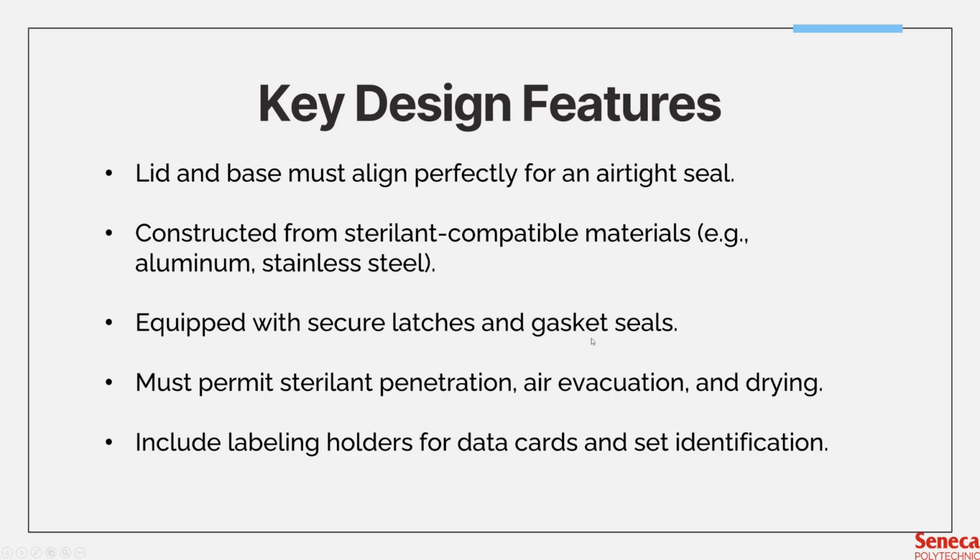Containers are also fitted with secure latches and gasket seals that prevent contamination once the sterilization is complete. And of course, it must allow for proper sterilant penetration, air evacuation, and drying during the cycle. Most containers include label or data card holders for set identification and tracking. All of these design requirements are outlined under CSA standard Z314, which ensures safe and consistent performance.